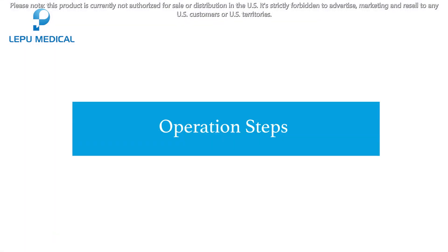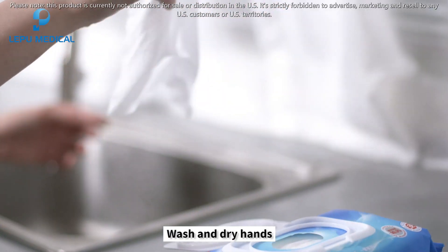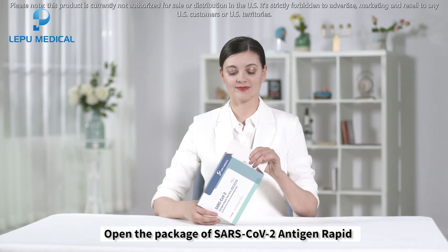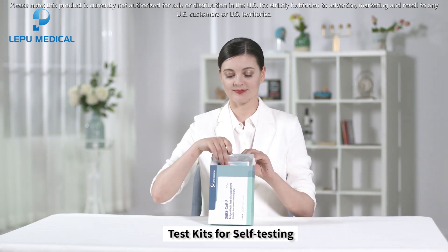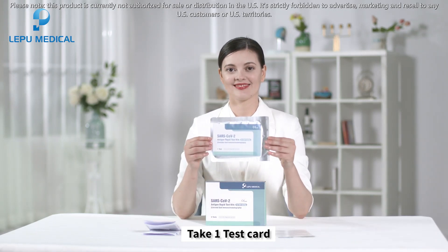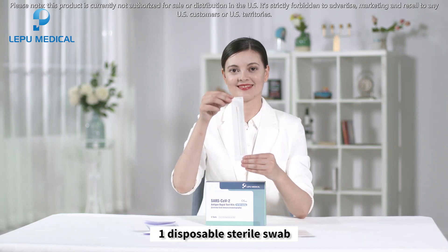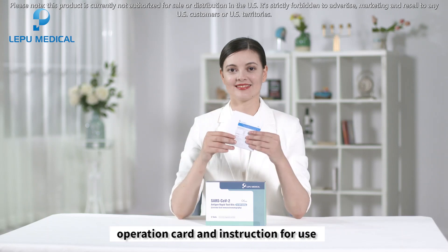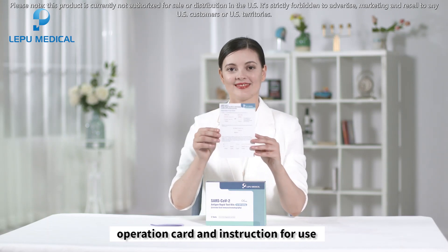Before the test, wash and dry hands. Open the package of the SARS-CoV-2 Antigen Rapid Test Kit, and take out one test card, one disposable sterile swab, one sample treatment solution, the operation card, and the instructions for use.